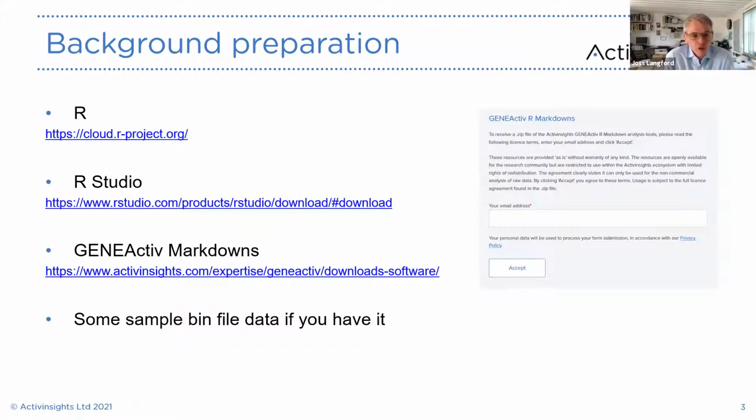And the other thing, if you did want to do a little bit of analysis, if you've got some bin file data for a GENEActiv lying around, then you could probably have a play with that whilst Charlie's talking.